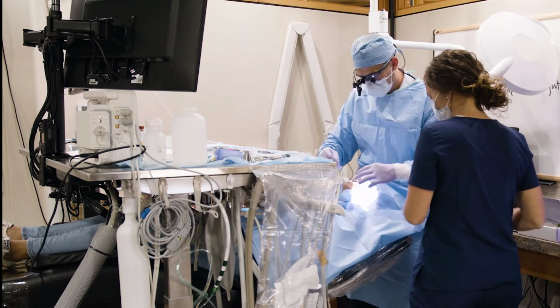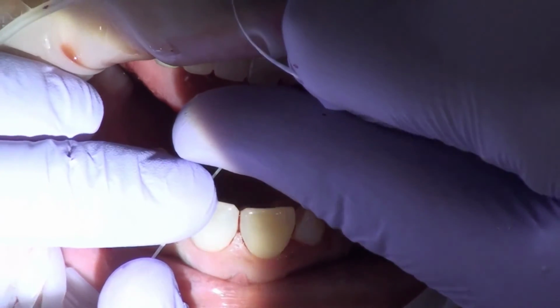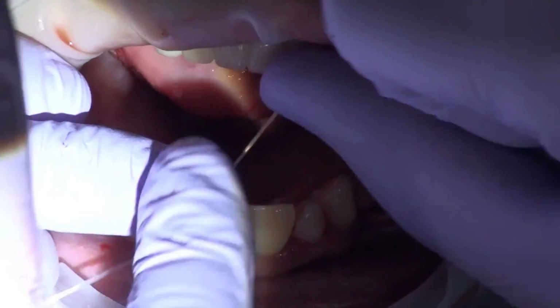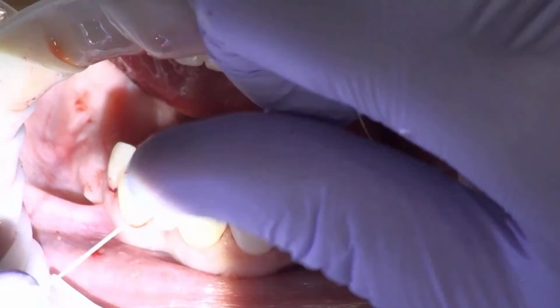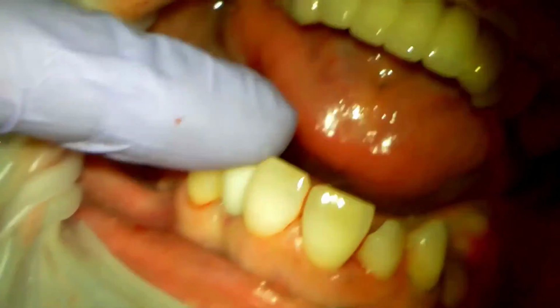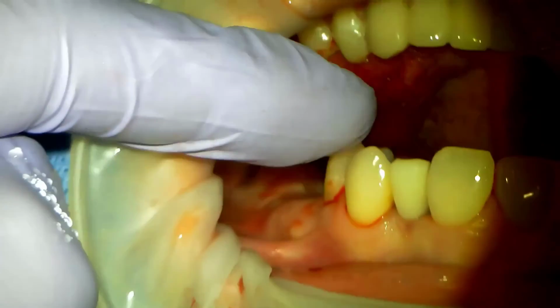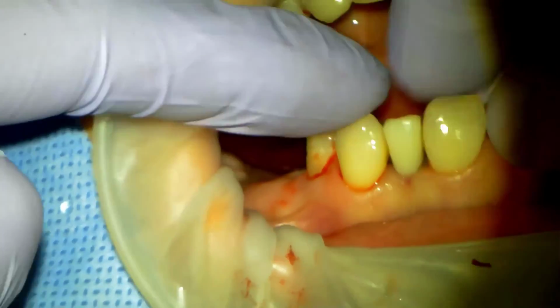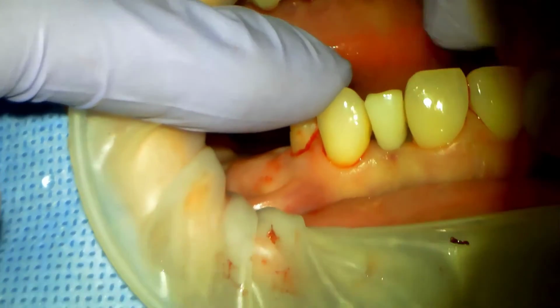I'm going to go ahead and have my assistant hold, and I'm going to floss right on top. Beautiful little snap there. Keep holding. Let's check the distal. Beautiful. Pretty remarkable. No proximal contacts done, no final impression obviously taken, but I'm seeing a crown right now that has perfect contacts mesiodistal because of the accuracy of the guide.